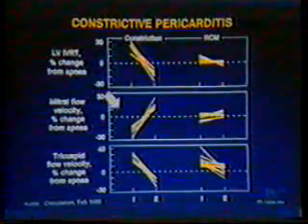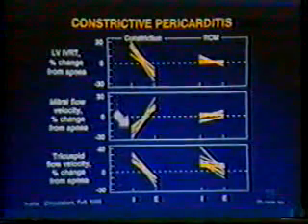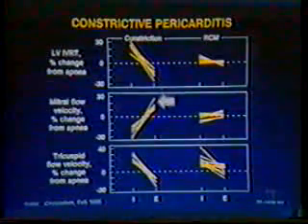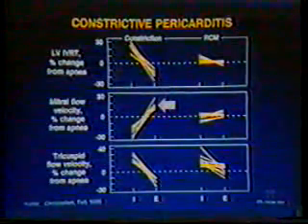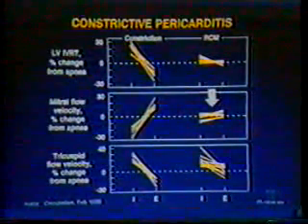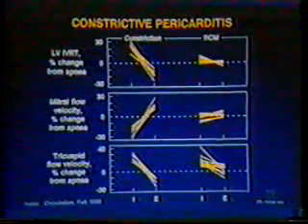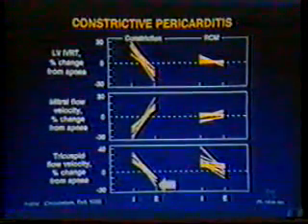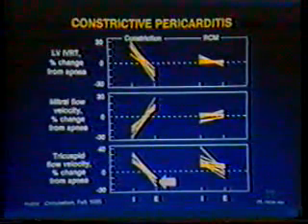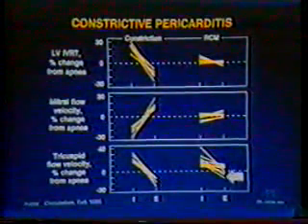This figure plots the mitral e-velocity during the respiratory cycle. The marked decrease in e-velocity with inspiration and increase with expiration that you have seen demonstrated for patients with constriction does not occur with restrictive cardiomyopathy. Similarly, the decrease in tricuspid e-velocity with expiration, which is consistently seen with constrictive pericarditis, is either non-existent or blunted with restrictive cardiomyopathy.